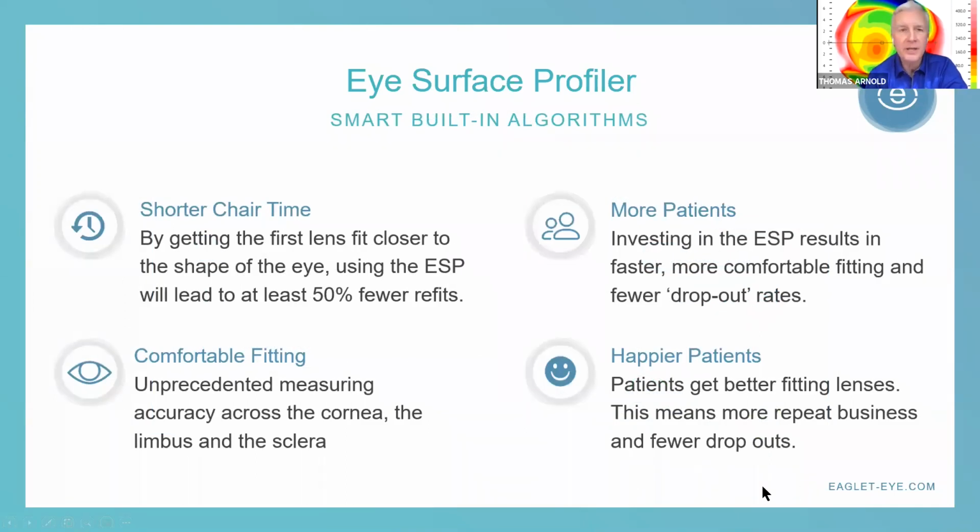When I started really getting into especially scleral lenses, about 7 years ago, and I started doing more complex cases, I was debating whether I needed more specialized tools like impression molding. I was talking to a good friend of ours, Christine Sent, and I said, well, I don't know about this. I'm doing fine with my one or two designs. And she said, kind of on the Field of Dreams movie model, if you build it, they will come. She told me that if you start doing this, you're going to get more and more complex and complicated cases. And that certainly has been the case.